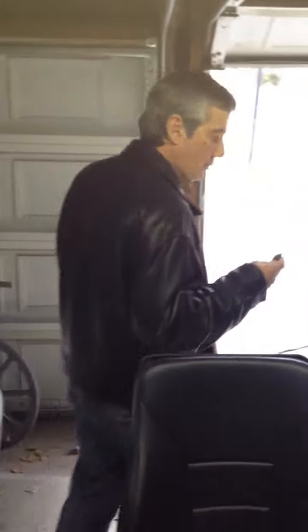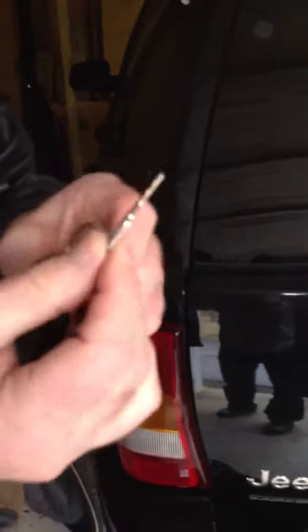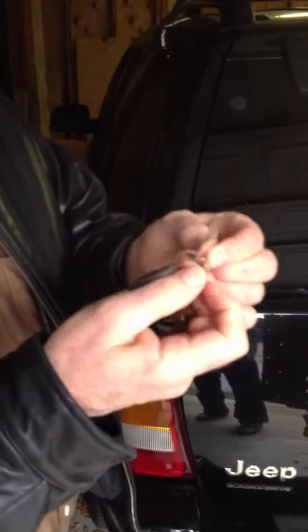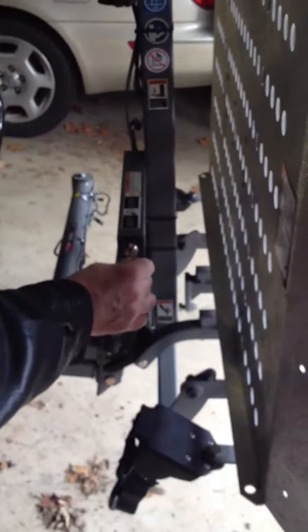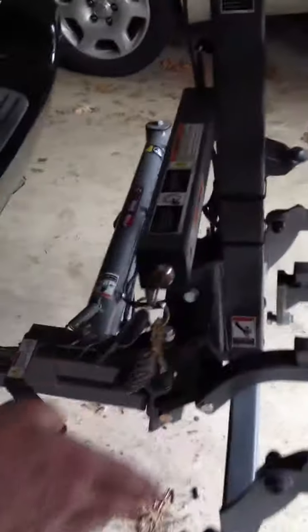We'll need the keys. We're heading back and we're going to lower the ramp. Remember, David told you there are two key rings and they're exactly the same. This is the key that will go into the ignition and lower the ramp — the silver key. If you look back, you'll see there is a key slot.